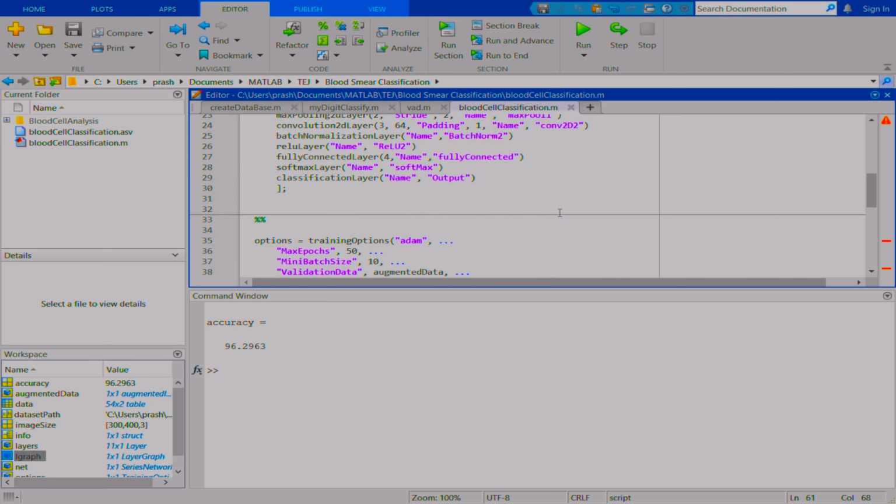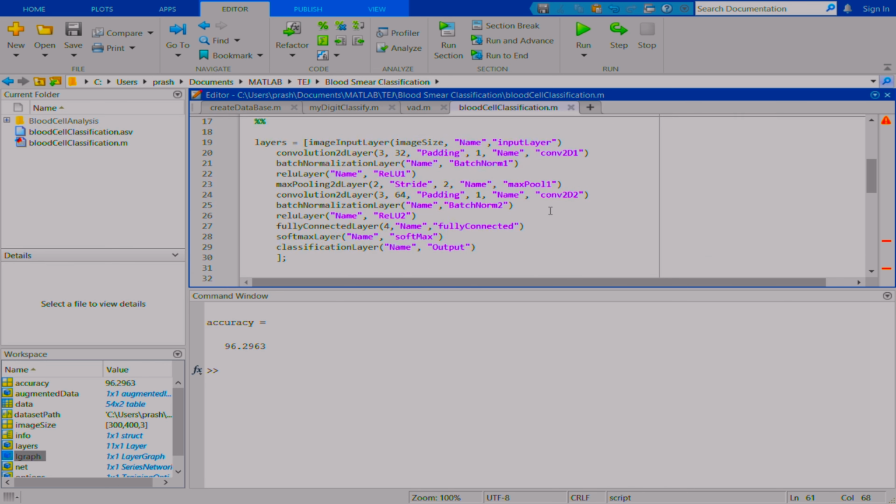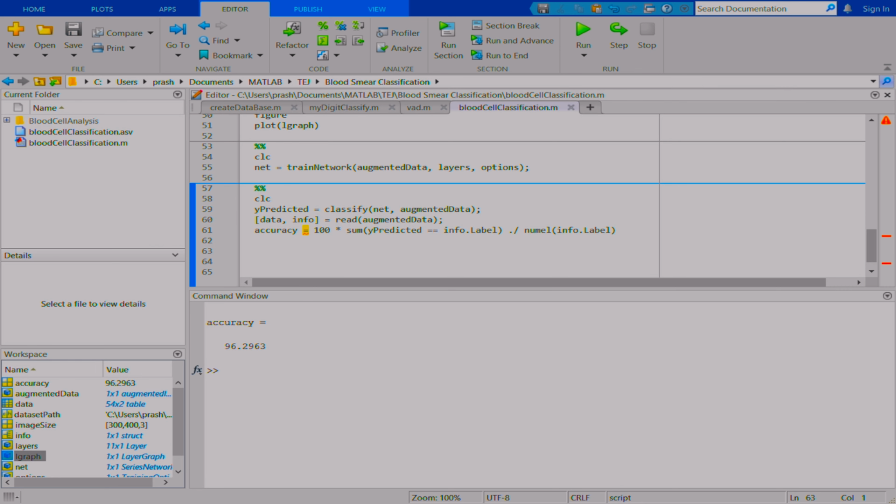Okay, so this is one part. What we could do now is that we built a model and we tested the model. Okay, training is also over. But in this case, I want to go one step ahead, and in the upcoming session, I'll show you how to visualize the various weights of this network, because this network has a lot of weights, right? Each of the weights I will try to show. Okay, so how to check that? Maybe we'll see that in the next class.